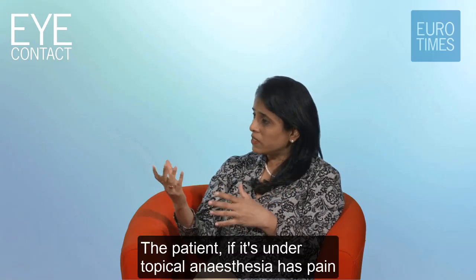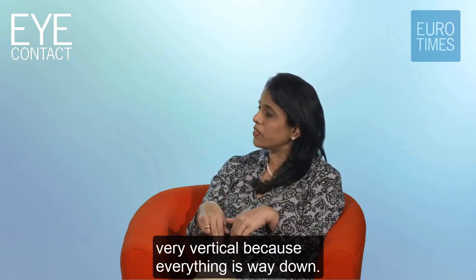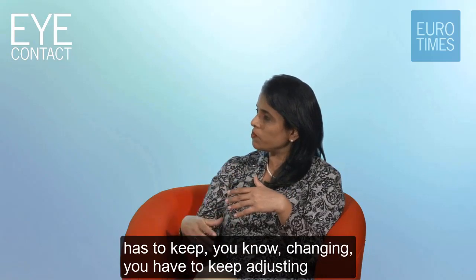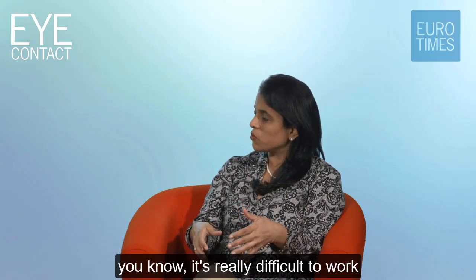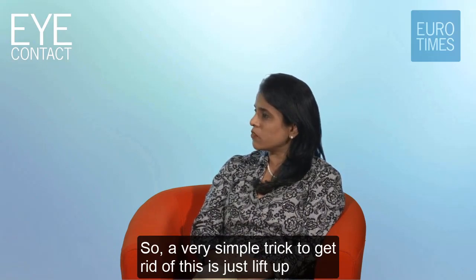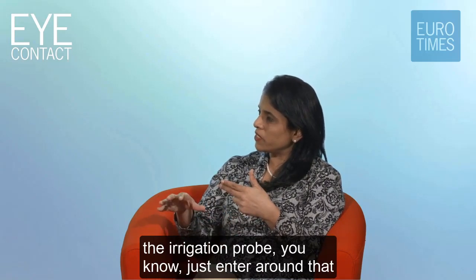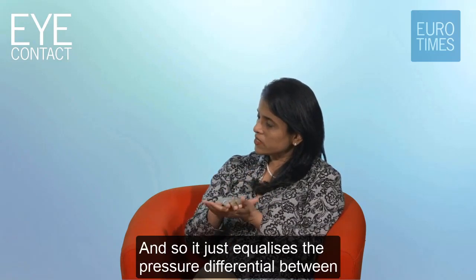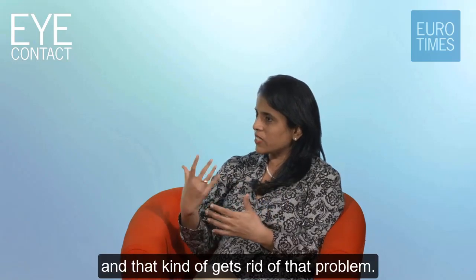The patient, if it's under topical anesthesia, has pain suddenly, and you find that you're suddenly forced to work very vertical because everything is way down, and your focusing range of the microscope really has to keep changing. You have to keep adjusting it because the lens is so much down that it's really difficult to work at that angle as well. So a very simple trick to get rid of this is just lift up the iris a little bit at one point and let the fluid from the irrigation probe just enter around that space under the iris, and so it just equalizes the pressure differential between the areas behind the iris and in front of the iris, and that kind of gets rid of that problem.